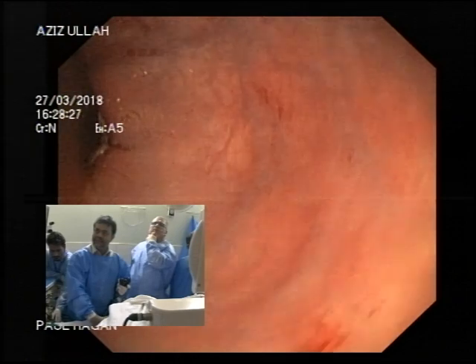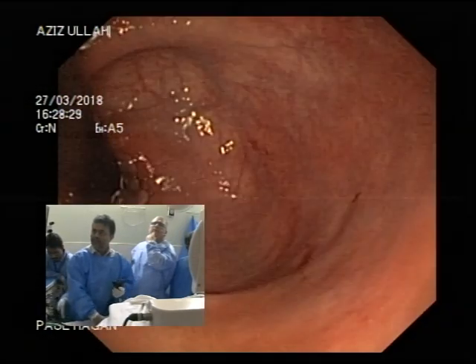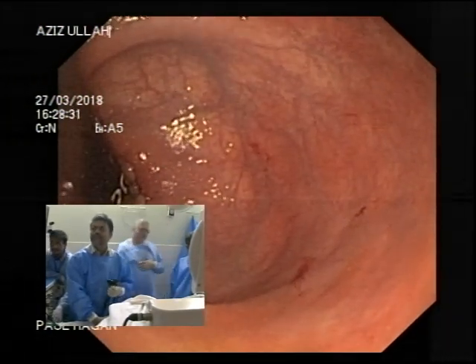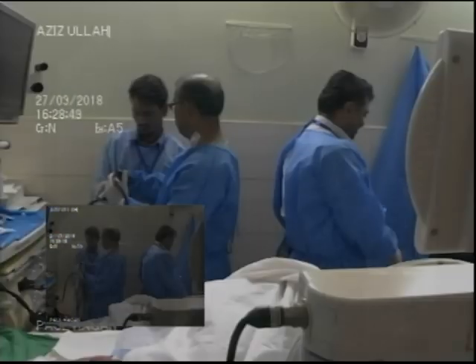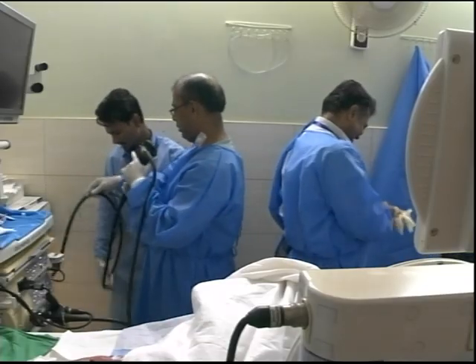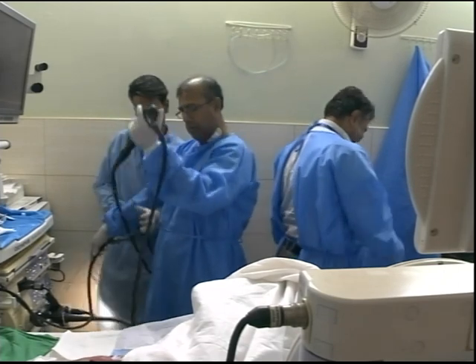Yeah. Good. That's it. Undo the J, take some air down, take the scope out. No. Aphthous is from the bowel prep. Keep the suction on. Good man. Keep the suction on. Good man. Dr. Paul? Keep the suction on. Good man.